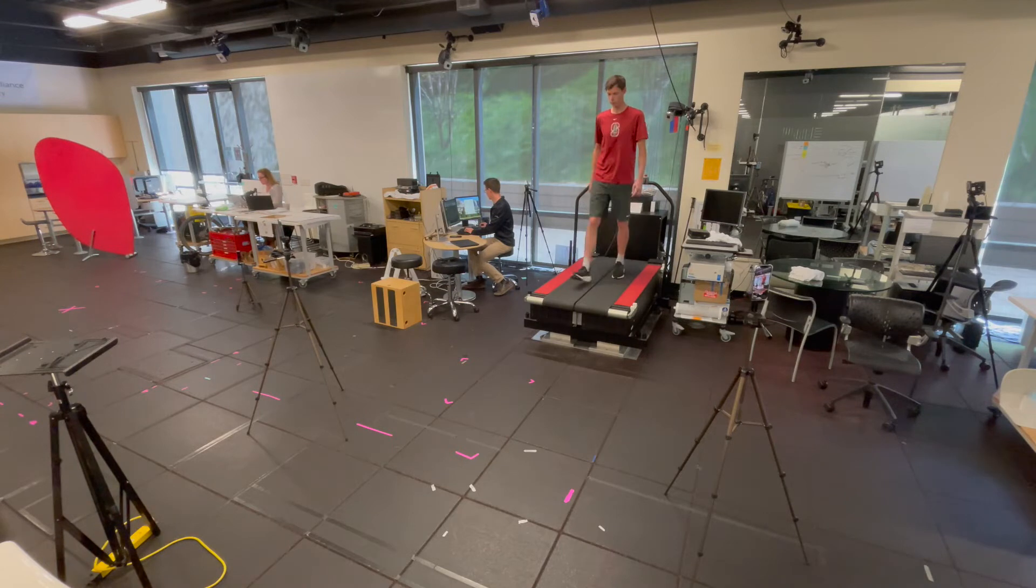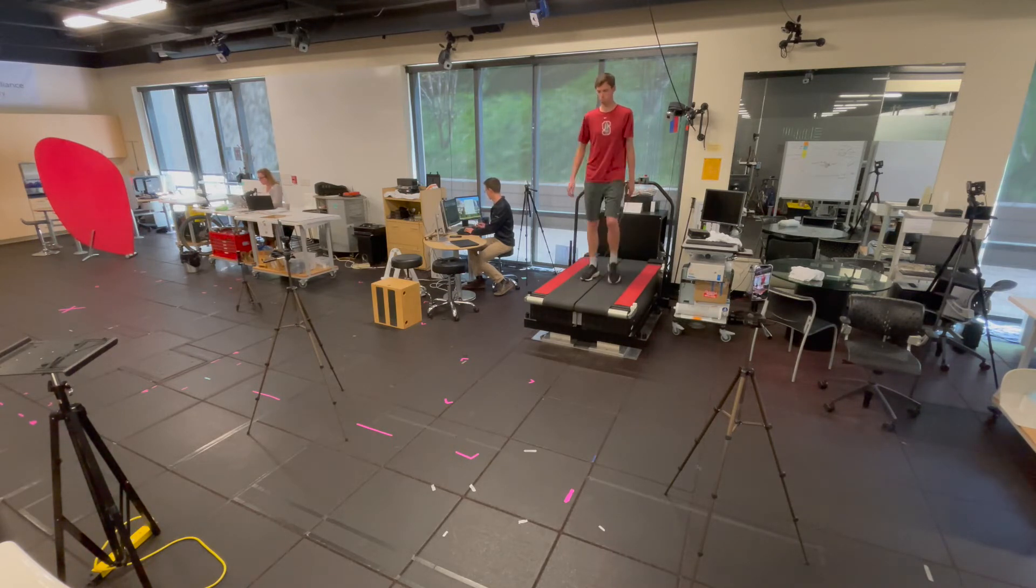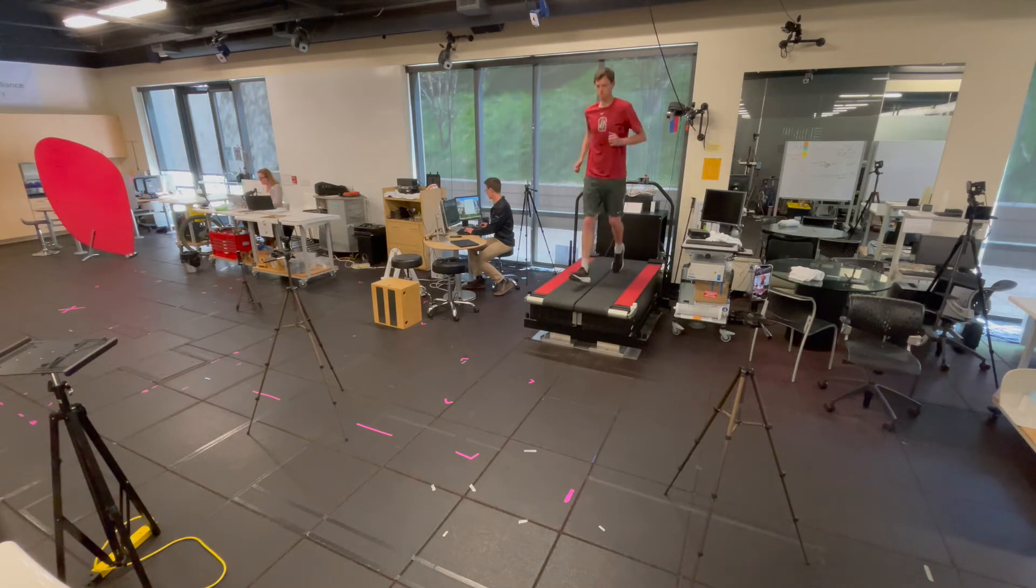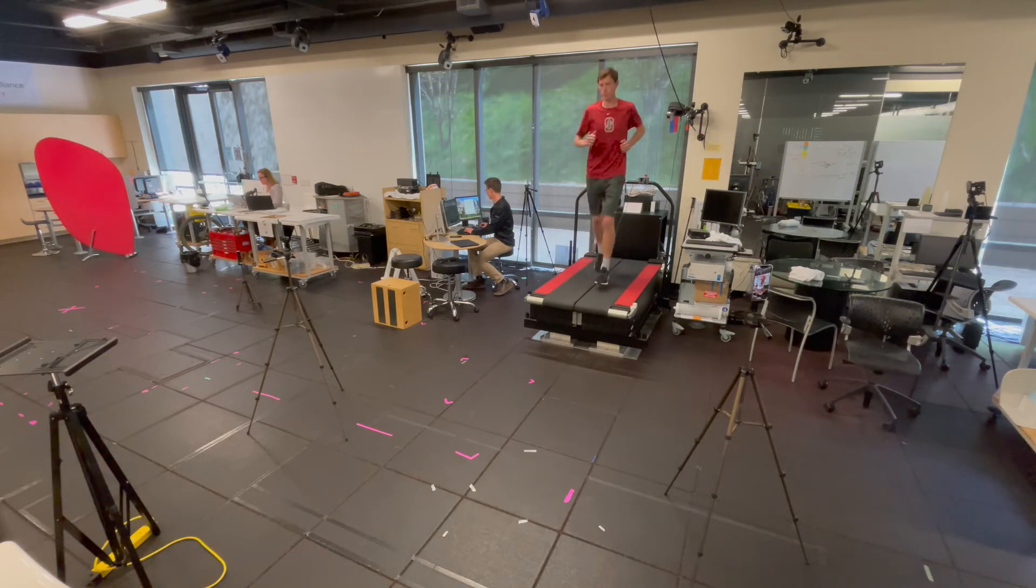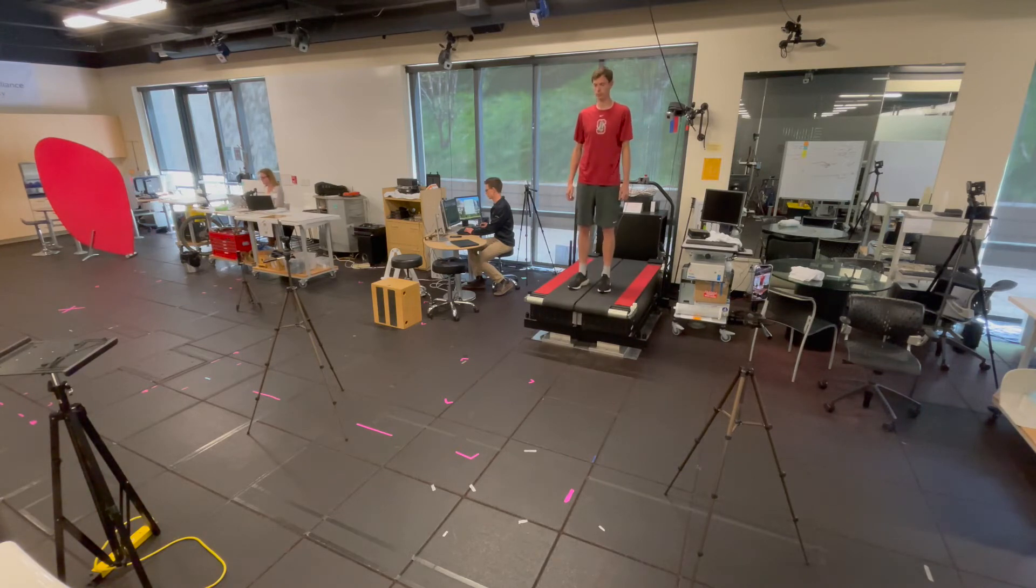Participants can walk and also transition to running. For the most robust collection, it is good to capture the treadmill slowing down before pressing stop on the web application.